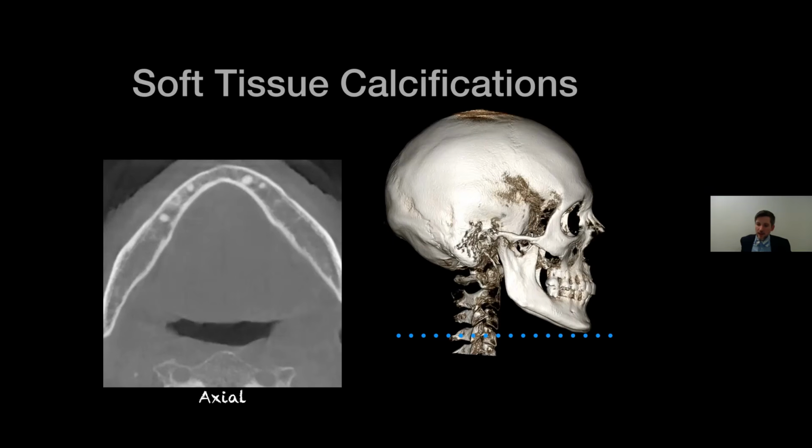Great, yeah. Someone asked about pans and the degree of magnification versus cone beam. So with pans, the magnification can vary very widely, especially with patient positioning errors.